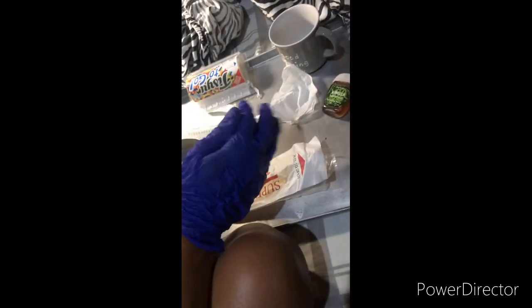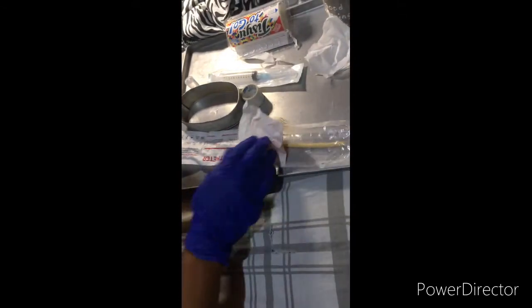Relaxation of external sphincter aids in insertion of catheter. Place distal end of catheter in a sterile bowl to measure urine volume or attach to drainage as indicated. Collection of urine prevents soiling of the client's bed, linens, and allows accurate measurement of urinary output.